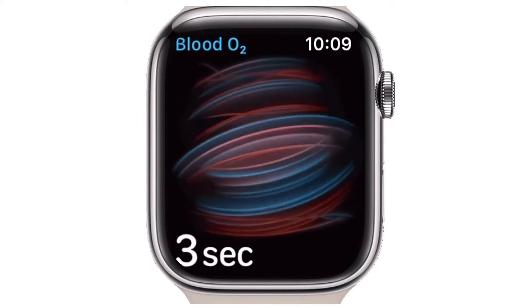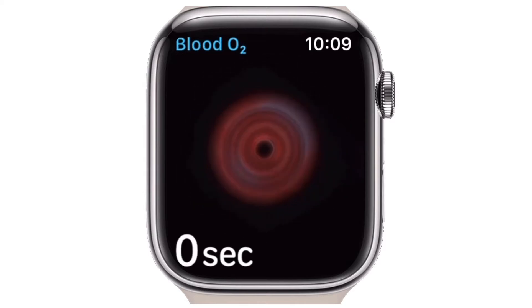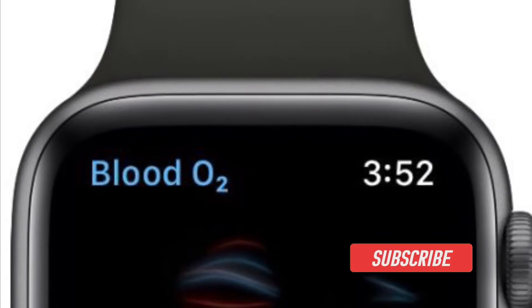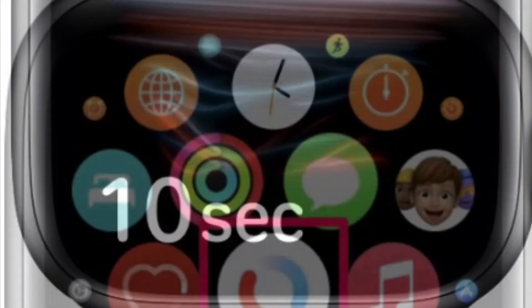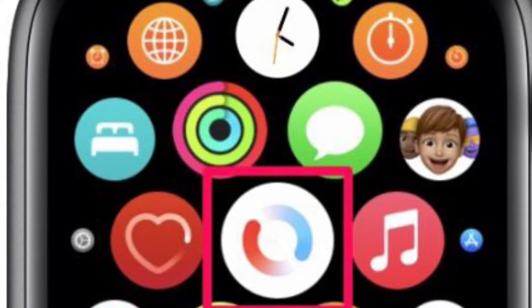That being said, let's learn how to measure blood oxygen level with Apple Watch. To get going, press the digital crown on your Apple Watch to access the home screen full of apps.